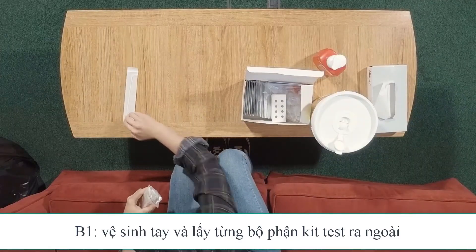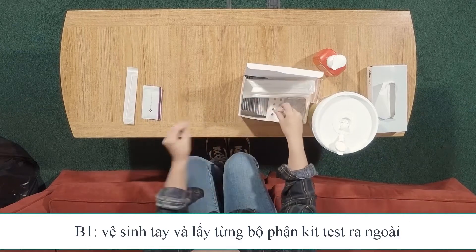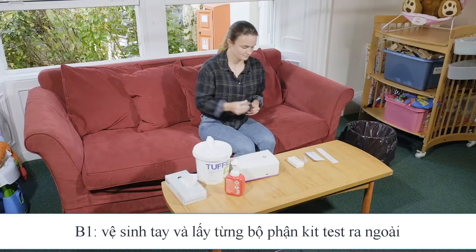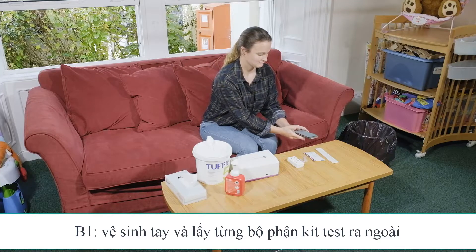You will need a swab, a test cassette, an extraction buffer solution vial, extraction tube, and a cardboard workstation. You will also need a timer or a clock which you can set to 10 minutes.